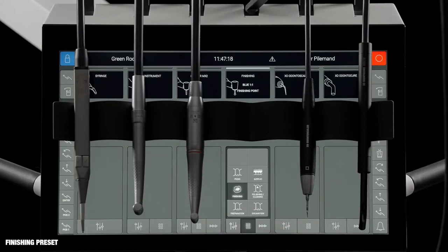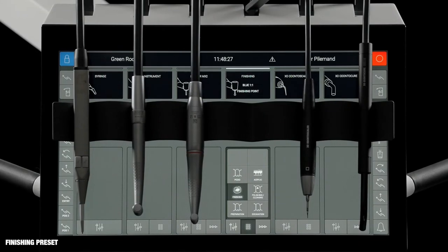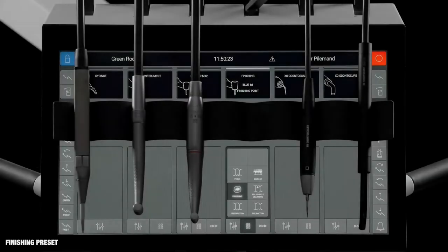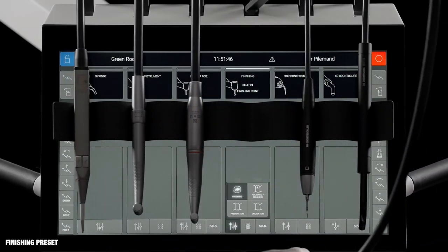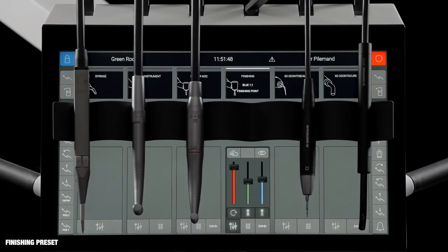Activate another preset with just one click. The finishing preset provides optimal instrument settings for finishing a composite restoration. The operators are instructed to fit a blue contra-angle and a finishing point. The speed of the point may be regulated up to 25,000 RPM using the foot control. In the finishing preset, the amount of spray is moderate, and the tactile function and the automatic chip blow are disabled.